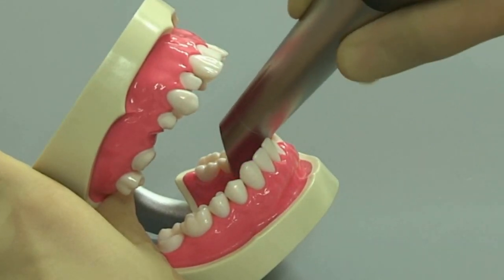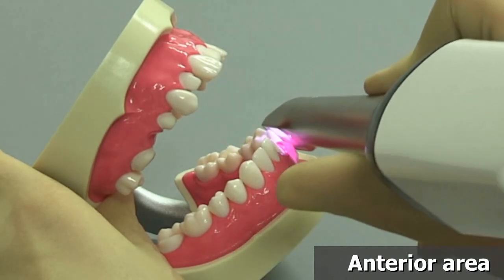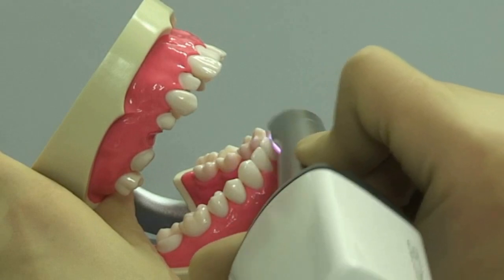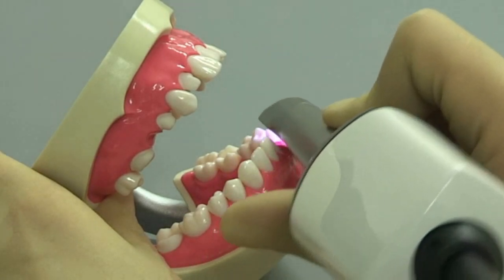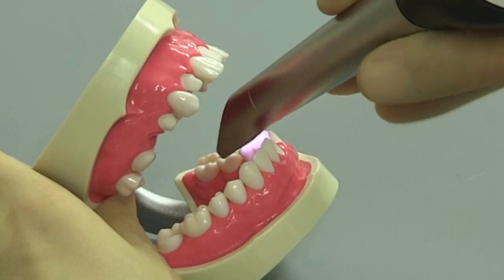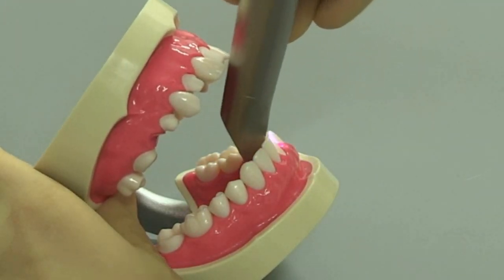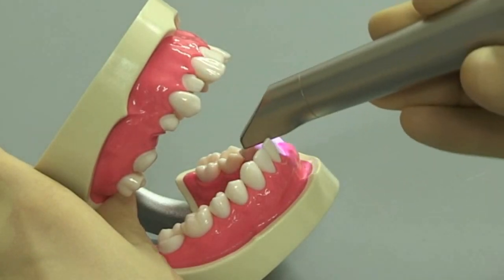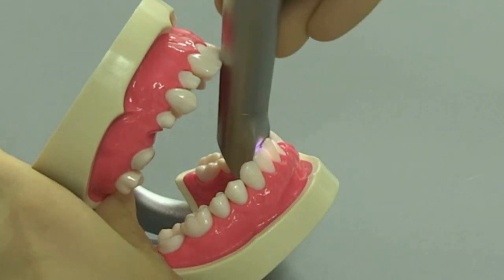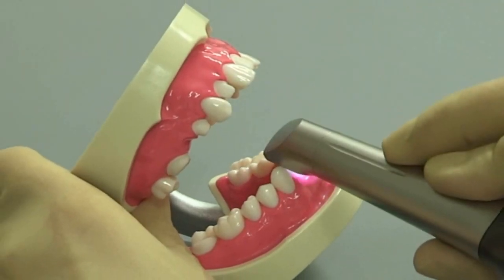Begin scanning the interior area by starting with the premolar. Guide the camera in the mesial direction labially over the interior teeth up to the first position of the neighboring quadrant, and from there back to the premolar. Pass the camera incisally over the front teeth in the mesial direction by moving the camera with a slight tipping movement over the incisal edge from labial to lingual.